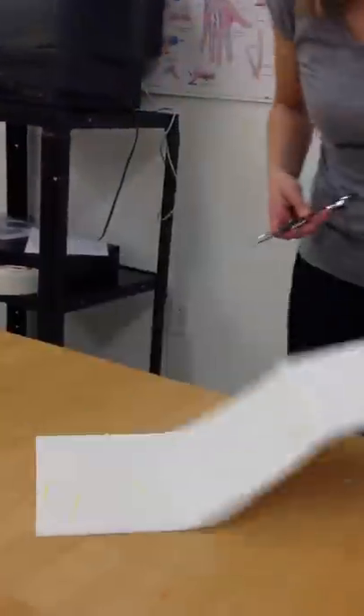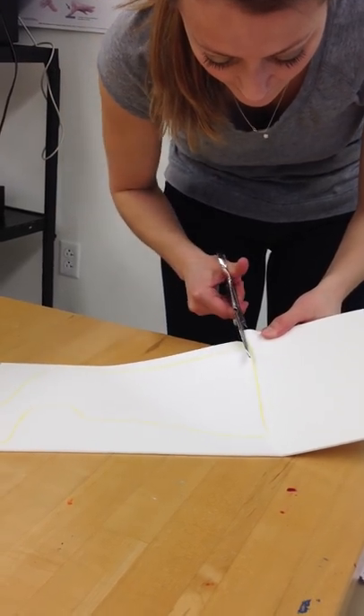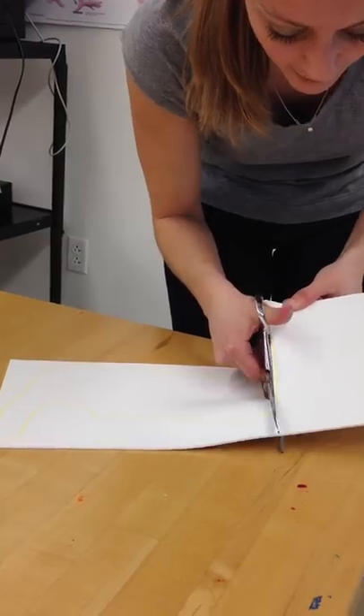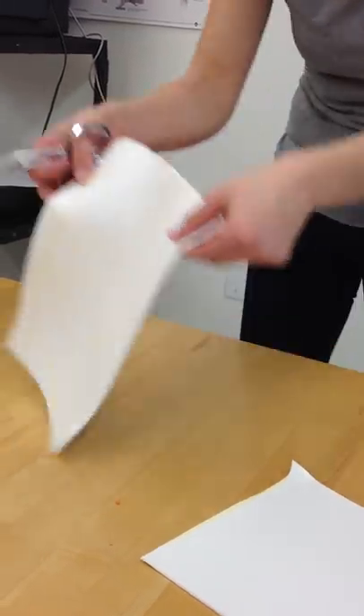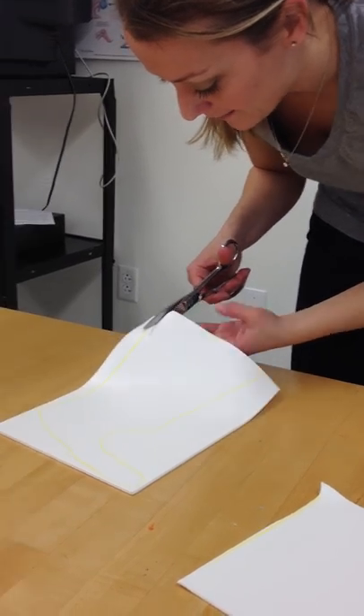I'm going to take it out. Whenever you are cutting, you want to do nice, long cuts. You don't want to be too choppy. And you're going to go right on the inside of your yellow.